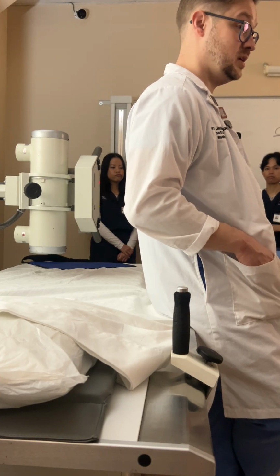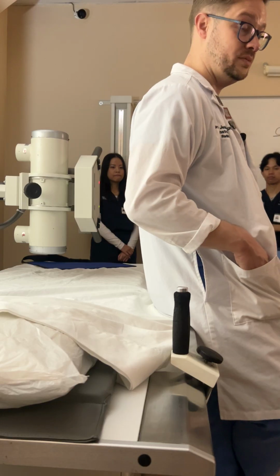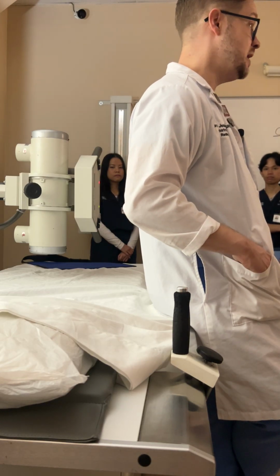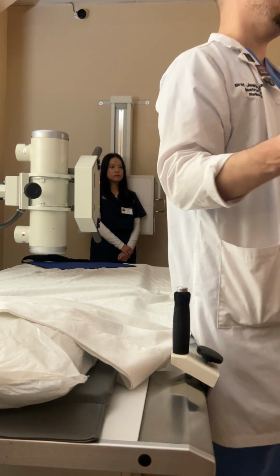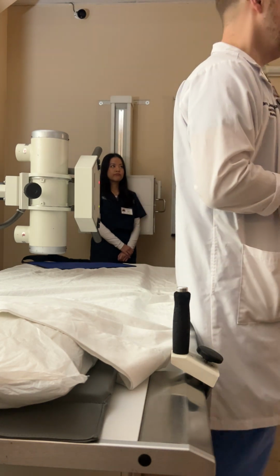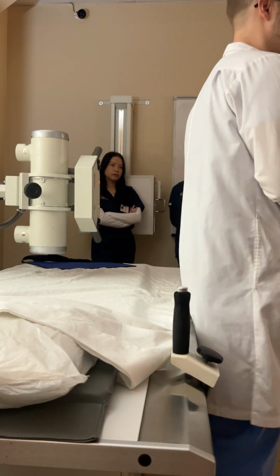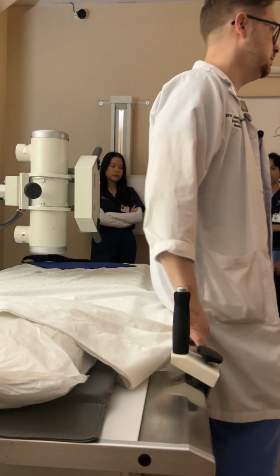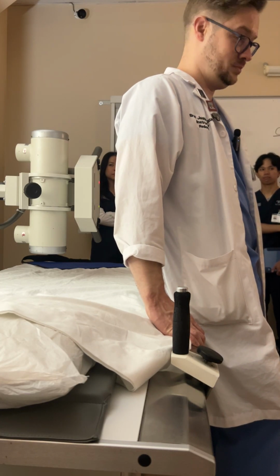We've got somebody who was in a car accident or got caught in a boat propeller. I've seen that. We have to get it right the first time. Why? Because everything else they are doing for treatment is sometimes waiting on us. If they're waiting on a chest x-ray, that patient can't go to CT, and can't do whatever other intervention they're waiting on. Also, the patient can only hold still for so long, so you want to do it quick.